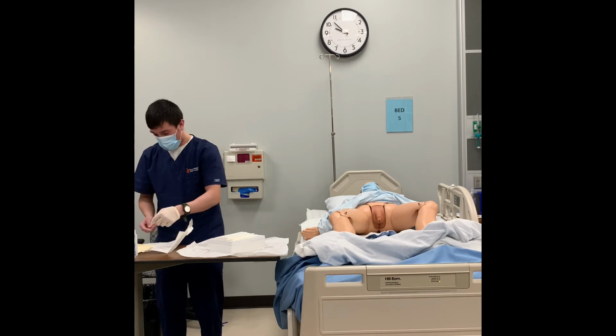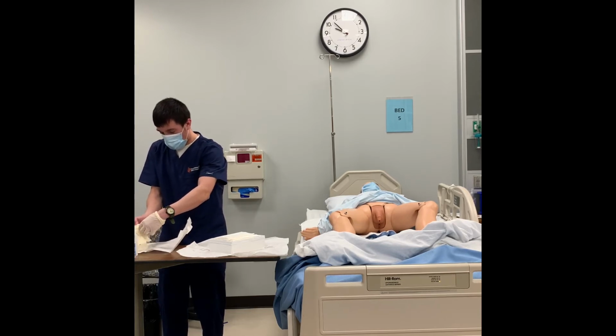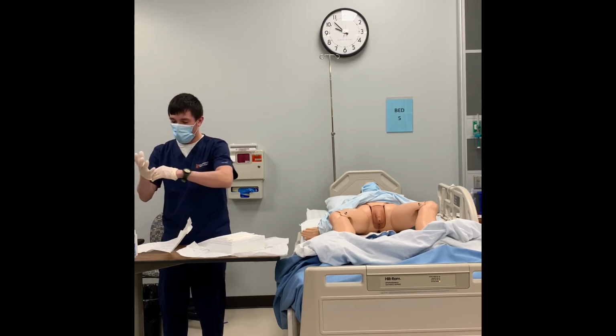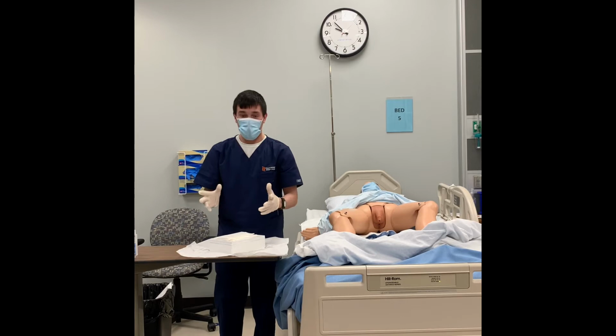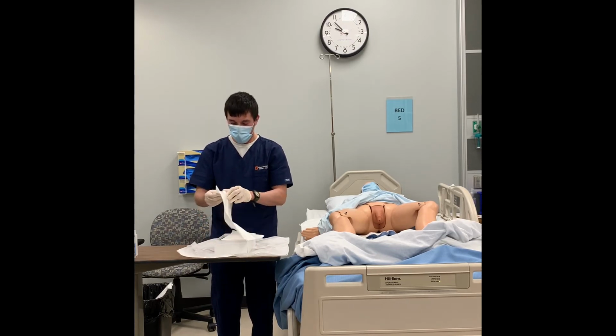Okay, and then from there, I'm going to the next one, and grabbing just that inside cuff and pulling up. Now I'm done with my gloves, pitch them, again, keeping my hands above, and now I can go ahead and adjust my box. So I have my first drape.